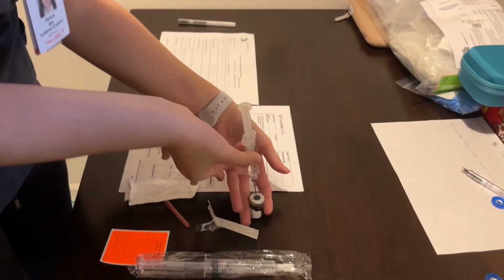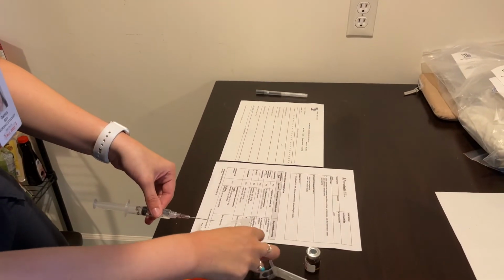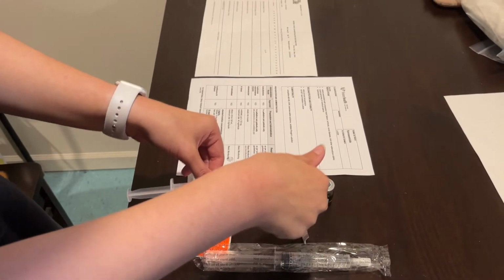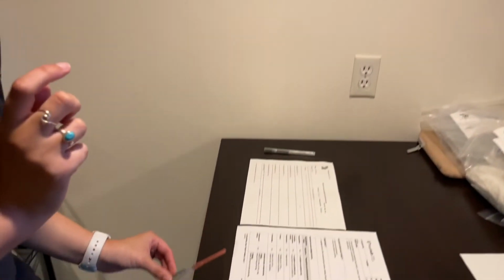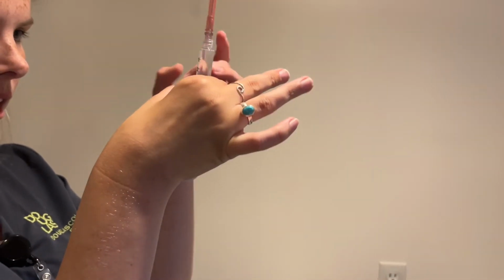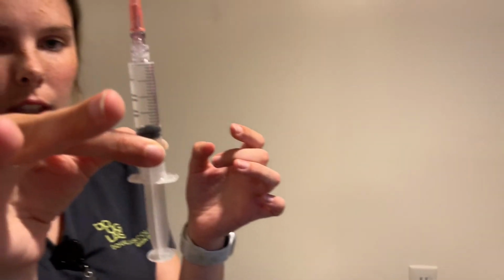Now, I have a little air bubble in there, but I will get that out. And I'm gonna safely cap my needle. Now, I'm just going to bang it on the desk just to get out the air bubbles. Make sure all the bubbles are gone. No bubbles.